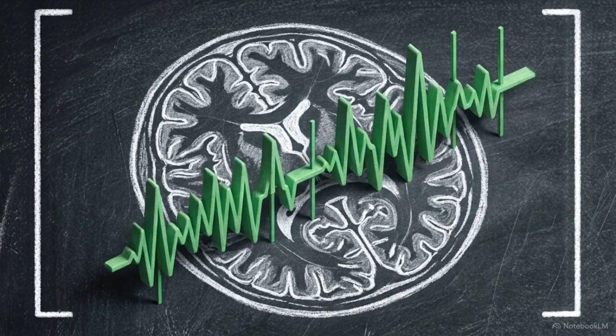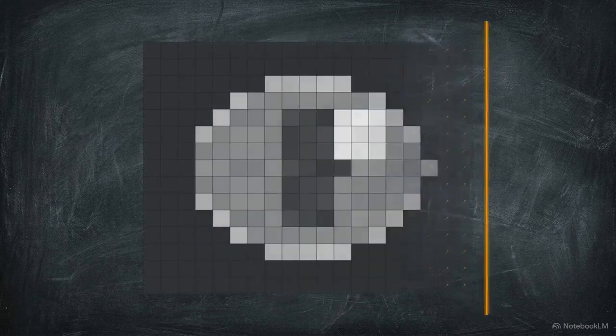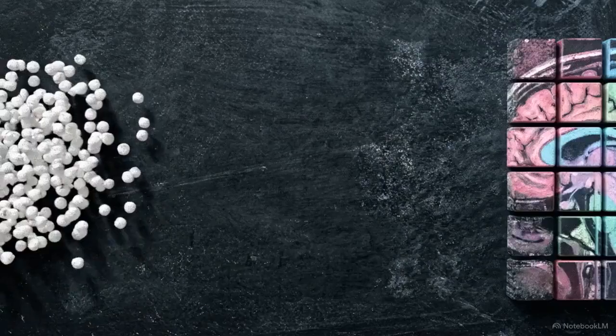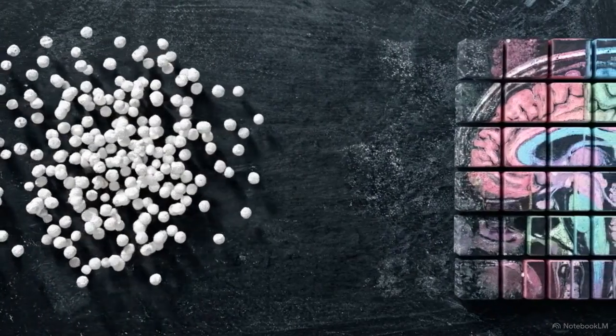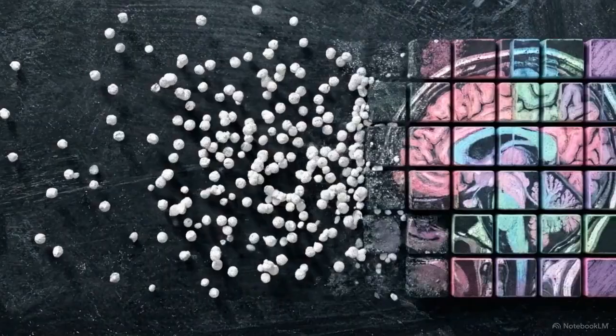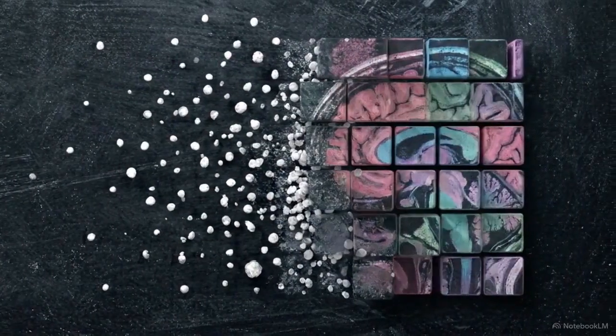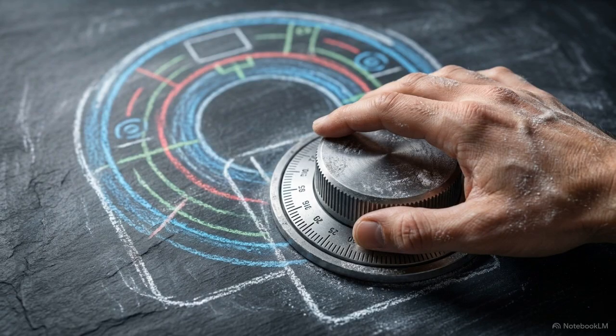MRI contrast is an engineered process of temporal filtering. The scanner never actually sees anatomy. It computes vector magnitudes at highly specific millisecond intervals. By mastering the strict parameters of the TR and TE matrix, the radiologist translates that raw, invisible quantum mechanics into a precise diagnostic tool. You control the timing, and the timing controls the image.